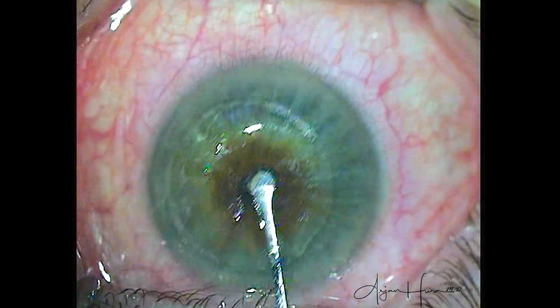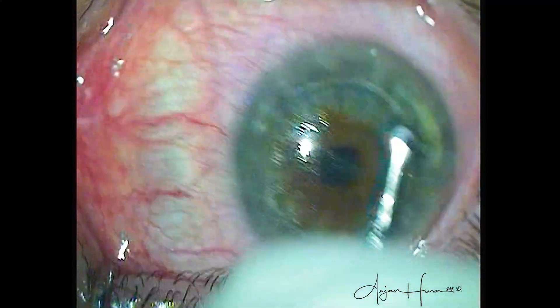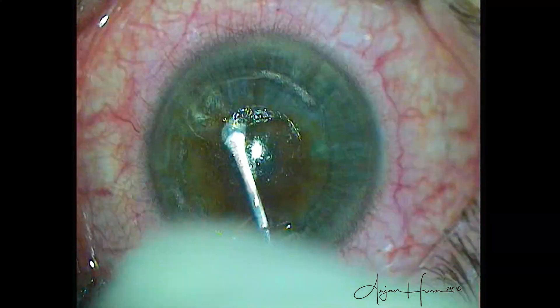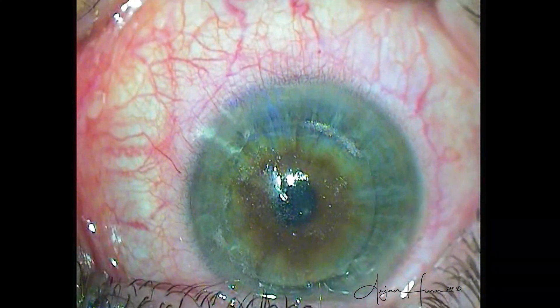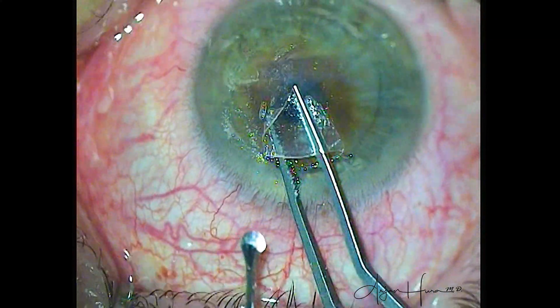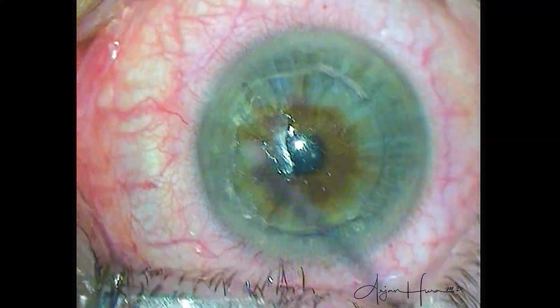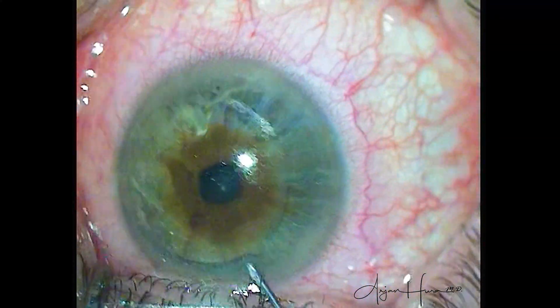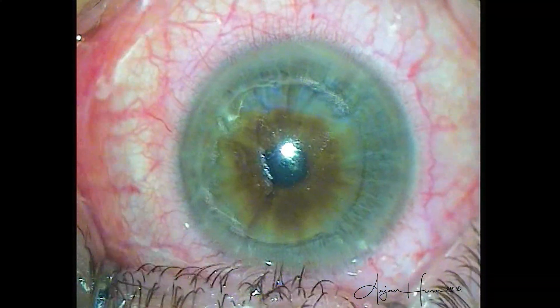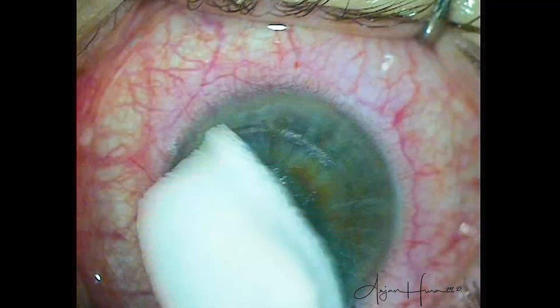Two final points. In SMILE, we just have to be concerned about abnormal blood vessels or pannus near the superior incision. But in the case of LASIK, the flap takes up a lot more surface area of the cornea than does the SMILE incision, so there is a greater potential for not just hemorrhage, but a significant amount of hemorrhage — that's why it's really important in the case of bleeding to thoroughly irrigate out all of the red blood cells from underneath the flap. Finally, if you think you're going to be in this situation, consider pre-treating prophylactically with neosynephrine either before the case has started or after the LASIK flap or SMILE lenticule have been created.